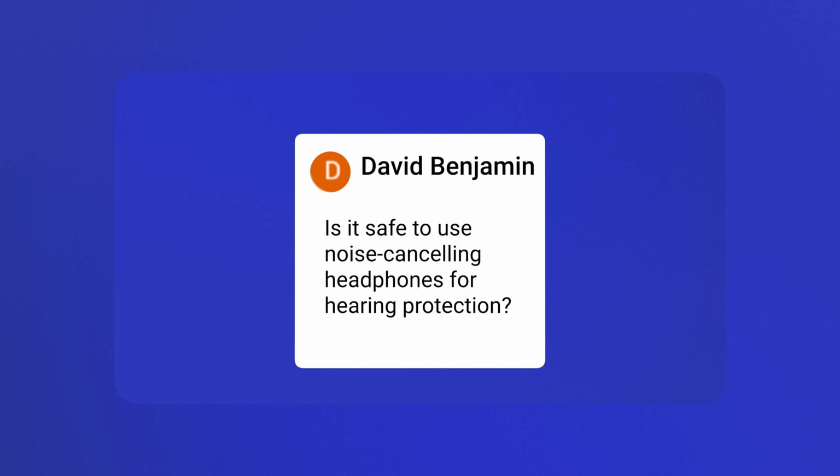This next question comes from David Benjamin. He asks, is it safe to use noise-canceling headphones for hearing protection? Ooh, this is a good one. The answer to that question is uncertain. The reason that I say that is that hearing protection has to go through very, very rigorous standards testing in order to be referred to as hearing protection.